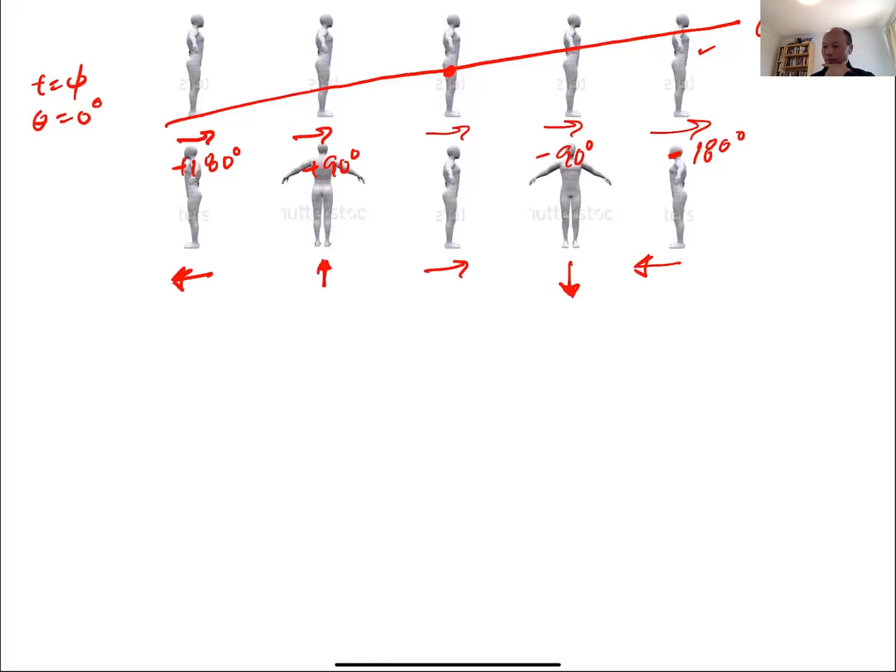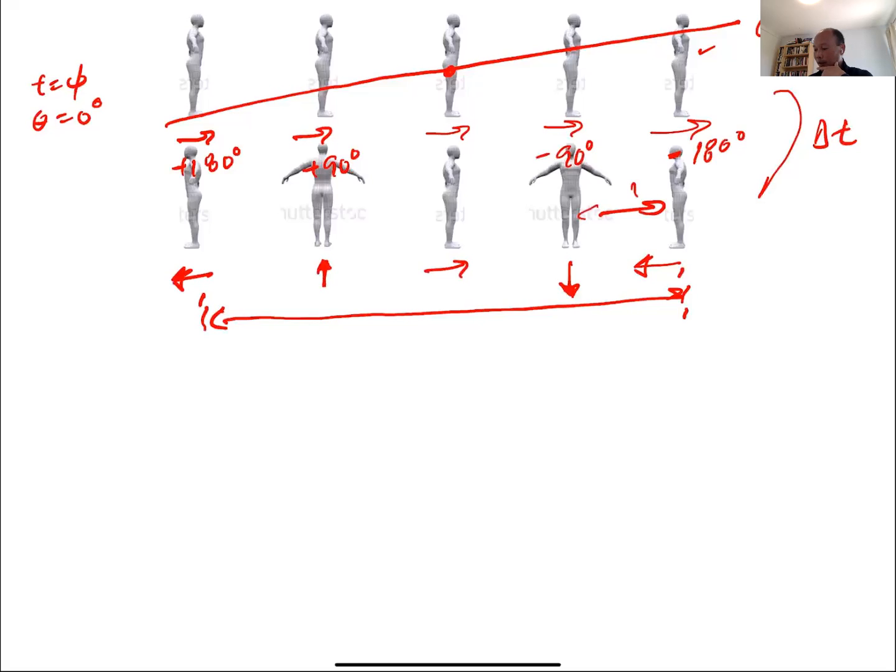So you can see that by just going one time step, we've already created this spatial pattern of the spins. For example, one period of that spatial pattern goes from here to here. Let's say the spacing is 1. Here the spatial period is 4, and that could correspond to kx equal to 1/4. So we would say that orientation of spins has a spatial frequency of 1/4.